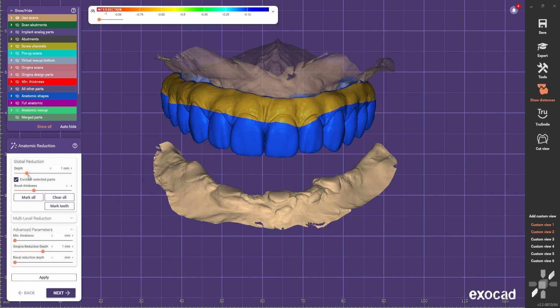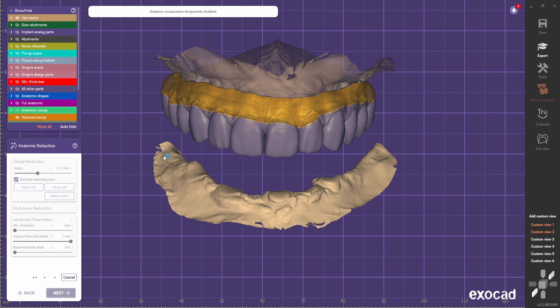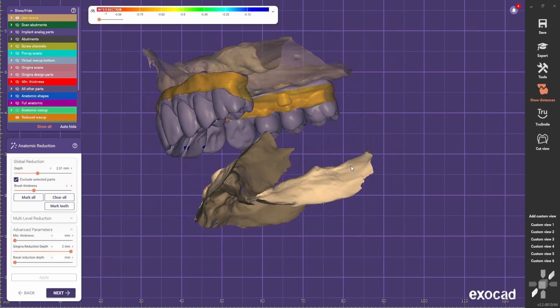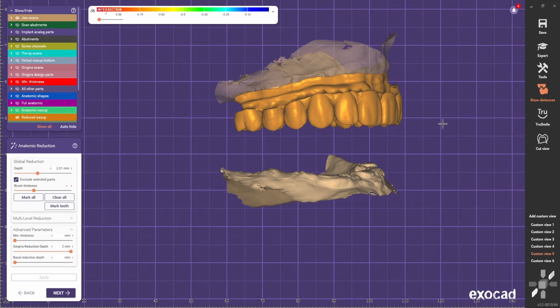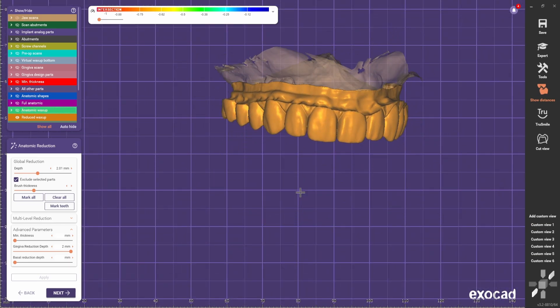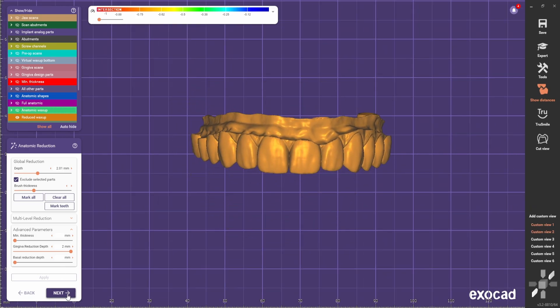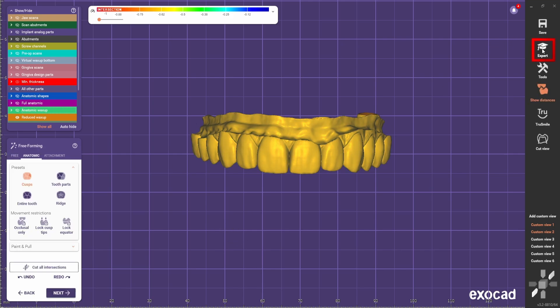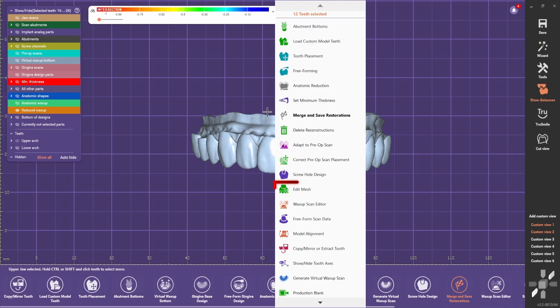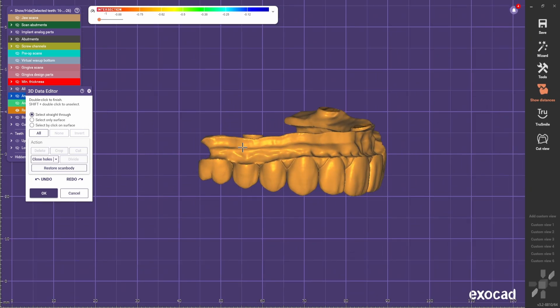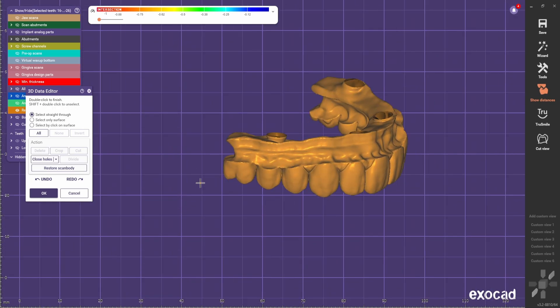We're going to do around 2mm. As you can see it reduced all around like this. The idea now is for us to cut all this part above and do the bar. So you go next, go to expert mode, and we're going to use the edit mesh. At this stage, the idea is to cut everything above around this part.